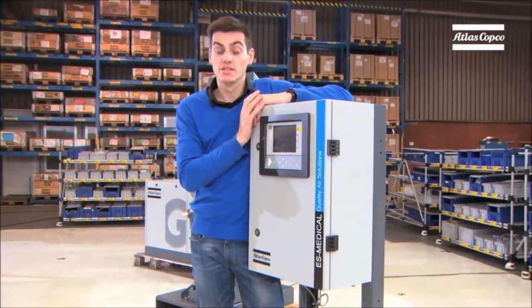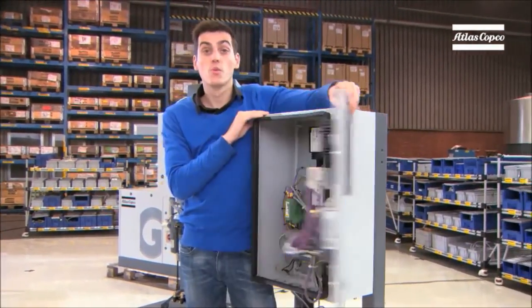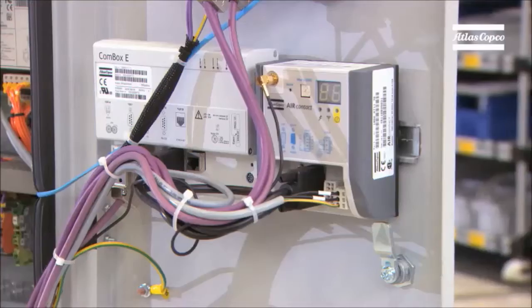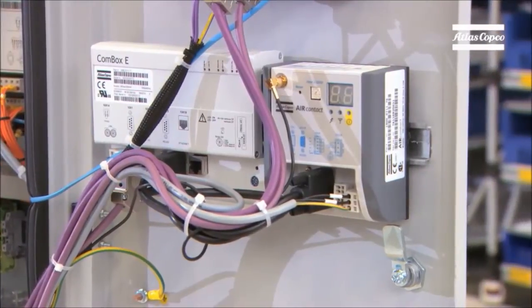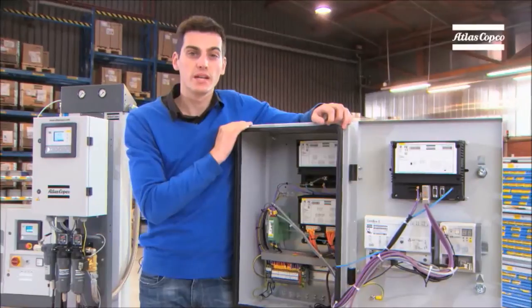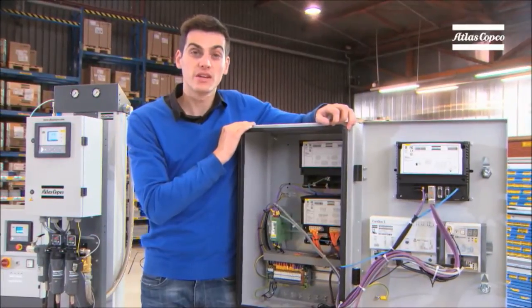Connectivity is very important these days. This controller supports a wide range of communication protocols such as Modbus and Profibus. In addition, the controller has an internet connection with built-in web browser. That means you can monitor your air plant from any location in the world. This is standard, not an option.